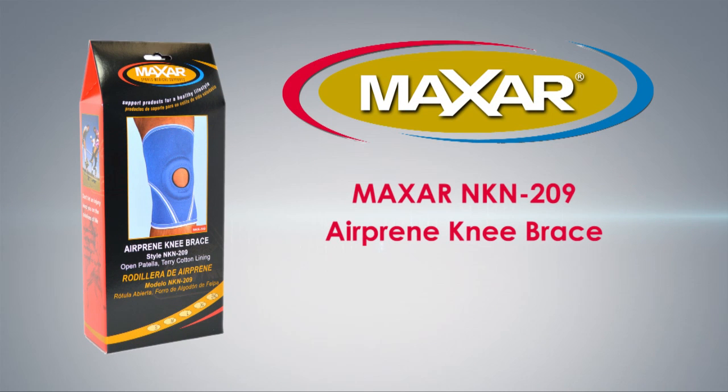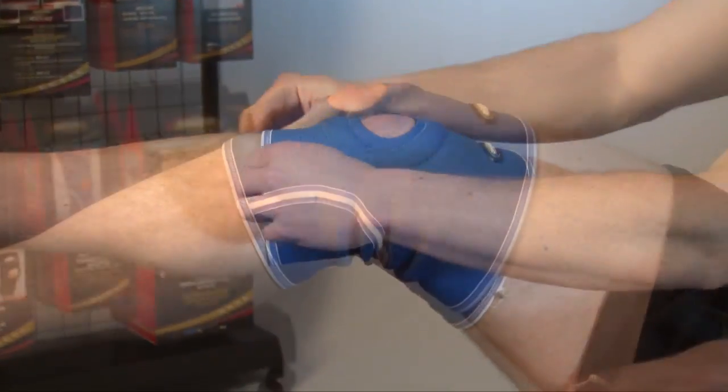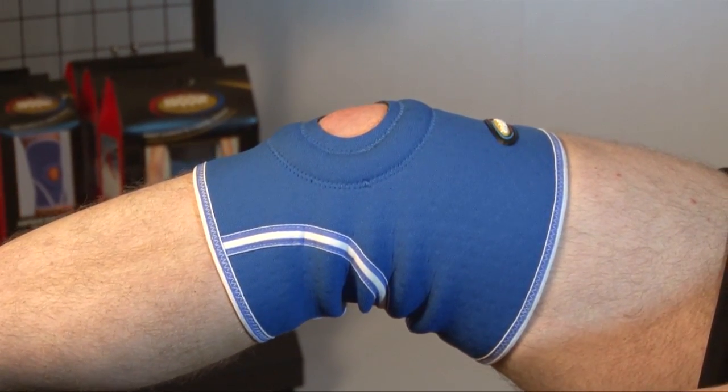The Maxar NKN-209 AirPrene Knee Brace provides excellent support for the knee and patella. Reinforced padded patella opening eliminates direct pressure and stabilizes the kneecap.